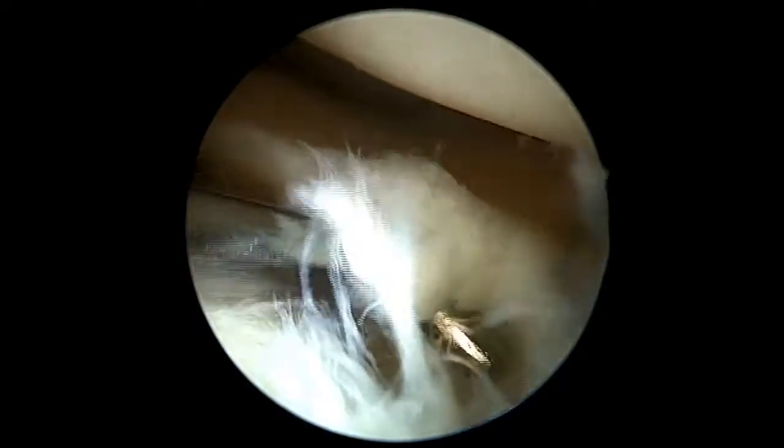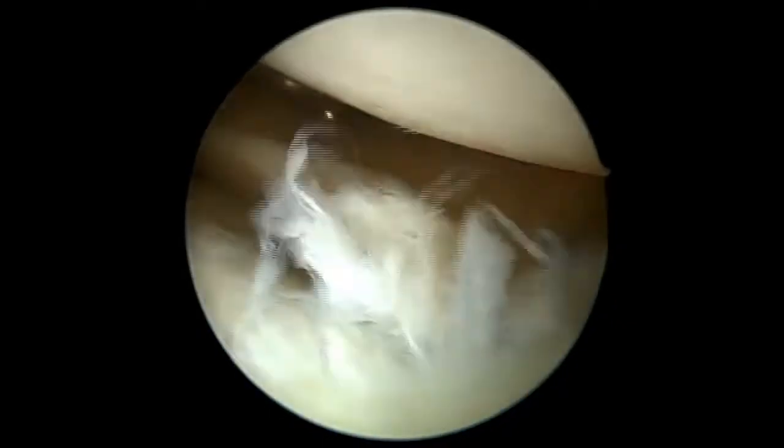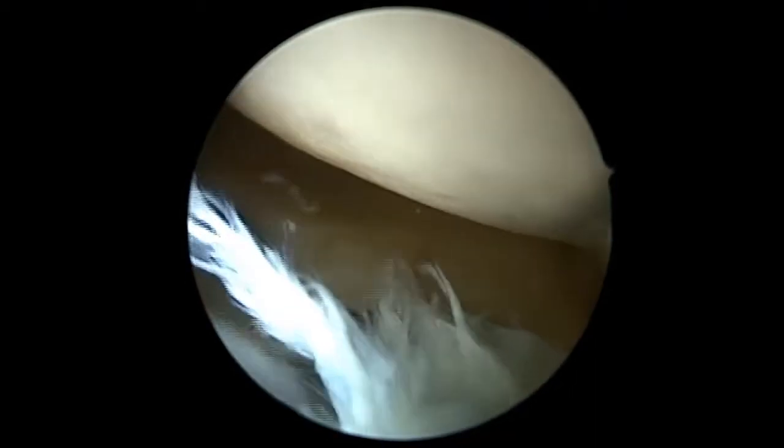An area of delamination is noted along the lateral tibial plateau, and a degenerative lateral meniscal tear is also noted. A 4.5 shaver is utilized to debride the lateral meniscus as well as the region of the tibial plateau.